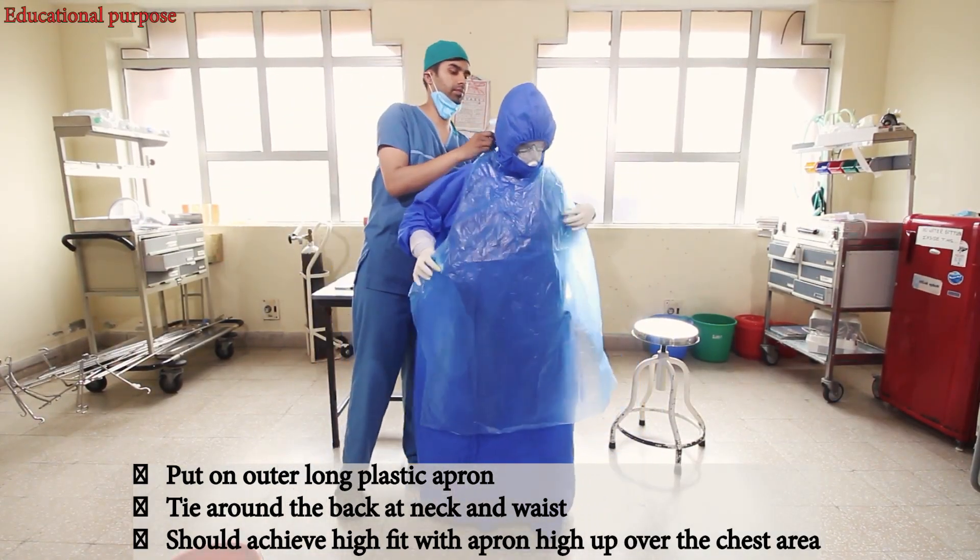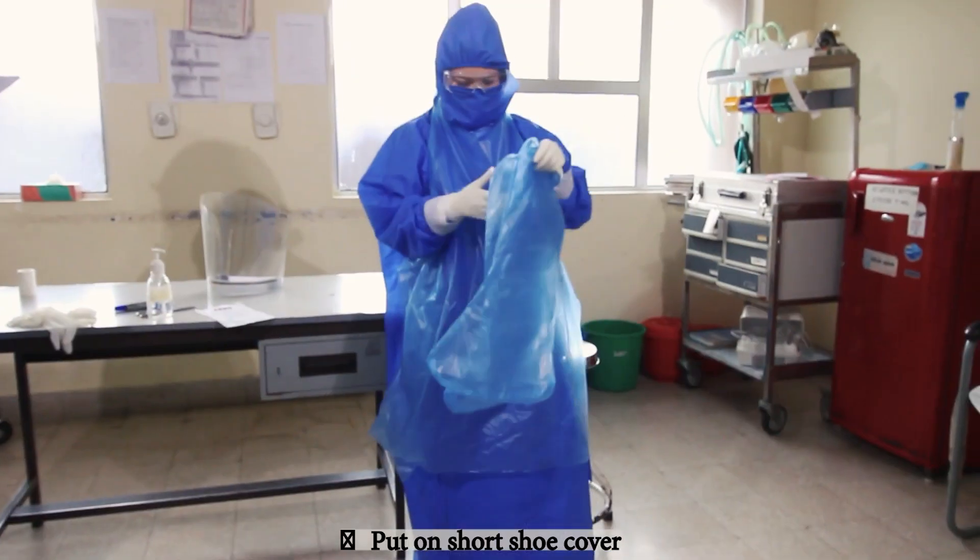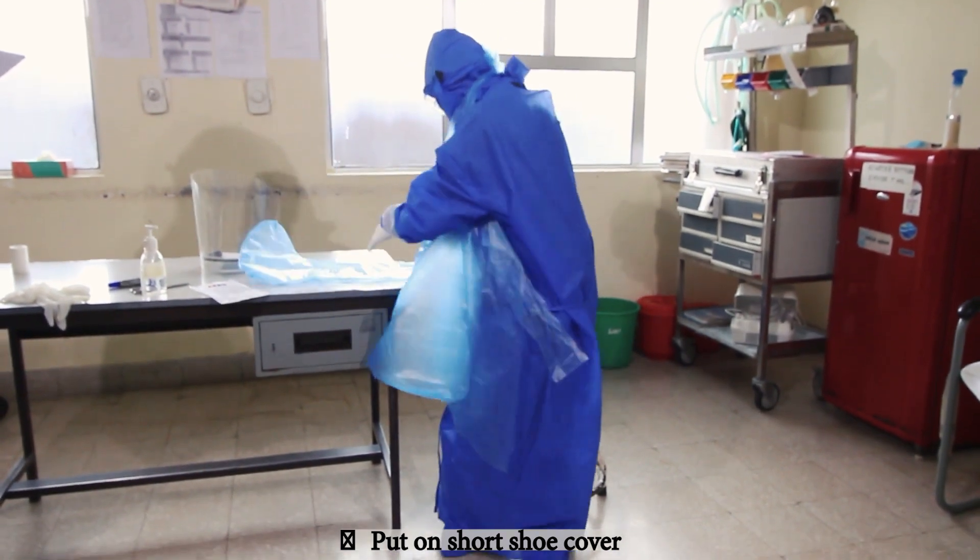After the second pair of gloves, now we put on the long plastic apron. Now we'll put on the short shoe cover.